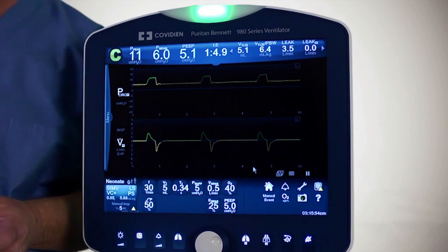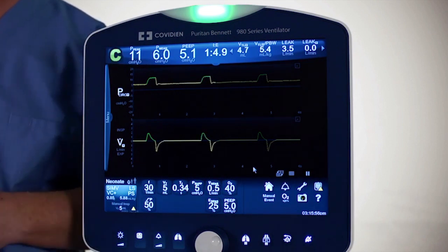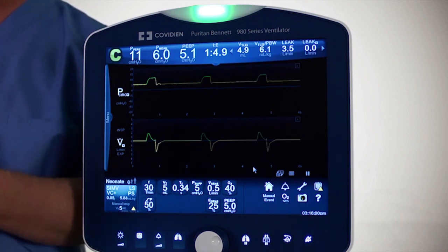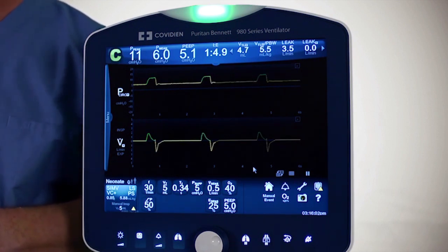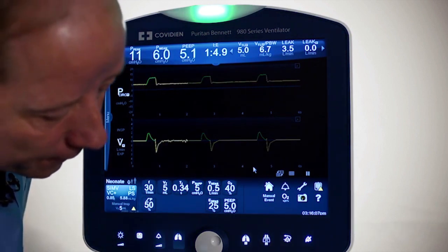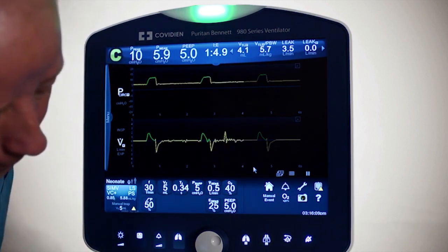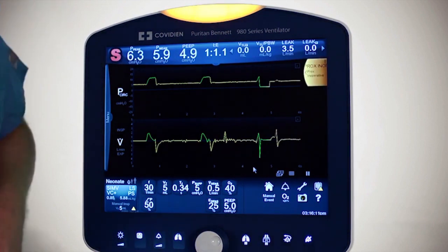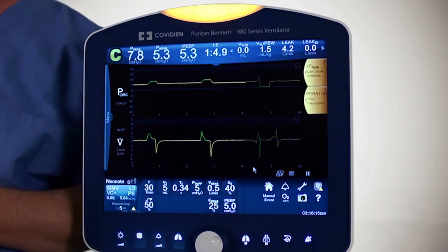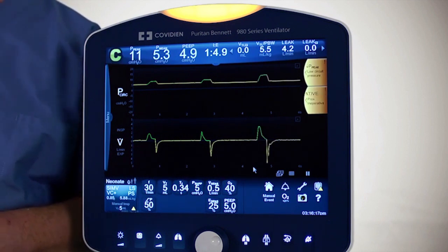The ProxFlow sensor is an accessory that you can use, and if there should be any problems with it, you may get specific alarms. For example, I'm going to disconnect the ProxFlow sensor to simulate an alarm. And we got 'ProxFlow inoperative.' Please look in the manual for other associated alarms with the ProxFlow sensor.